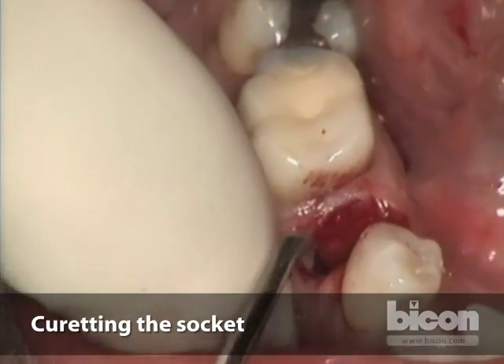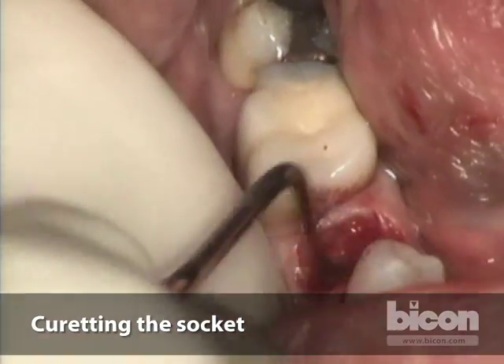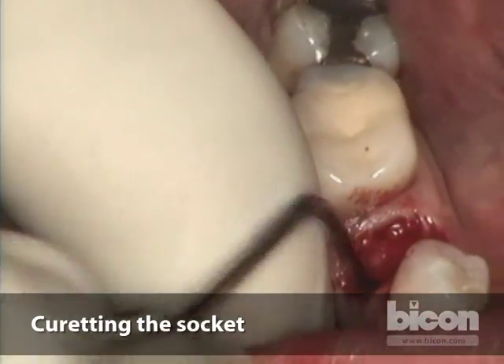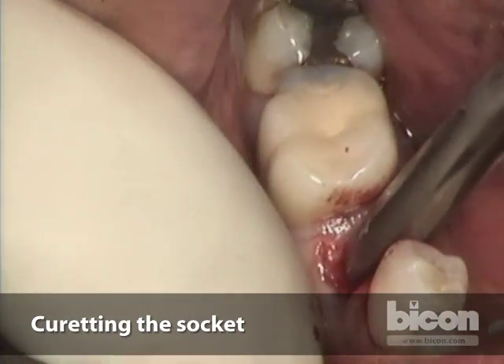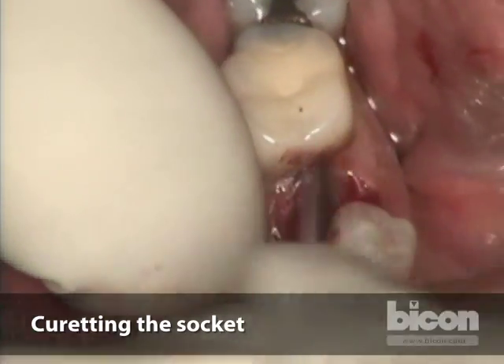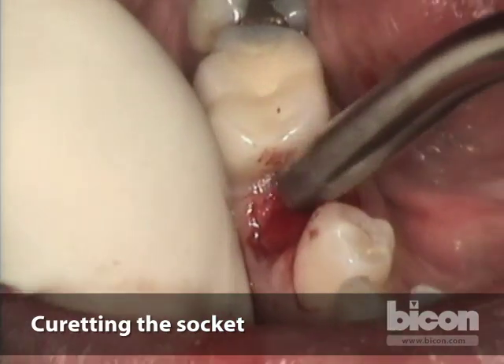Since this tooth had been endodontically treated, we want to make sure we remove any extraneous root canal sealer, gutta percha, or anything left in there — grossly identifying and removing the bulk of it so it's not interfering with healing and integration at the apical portion.